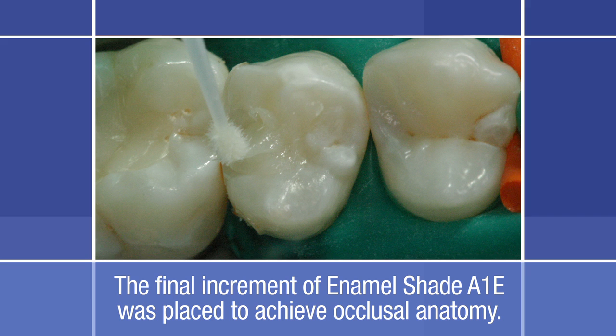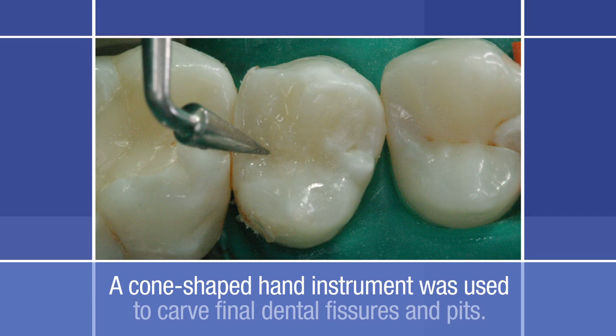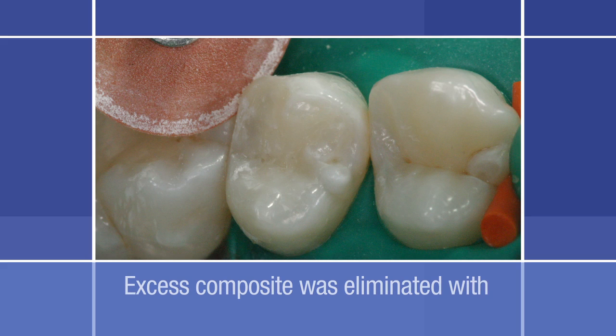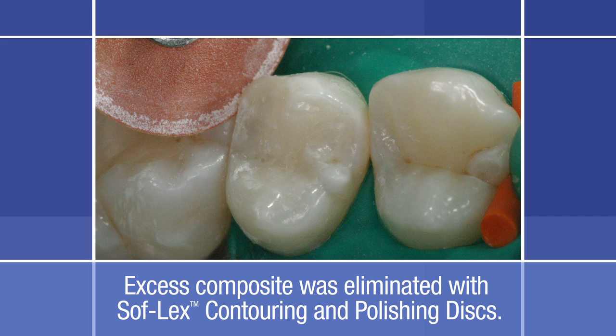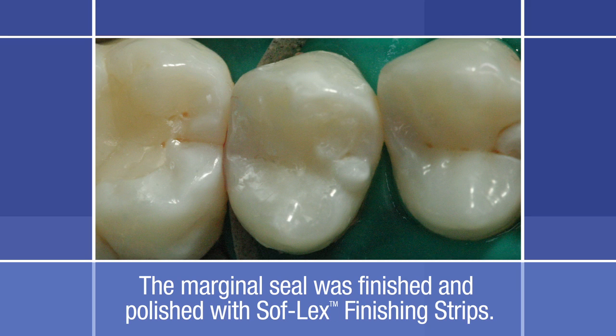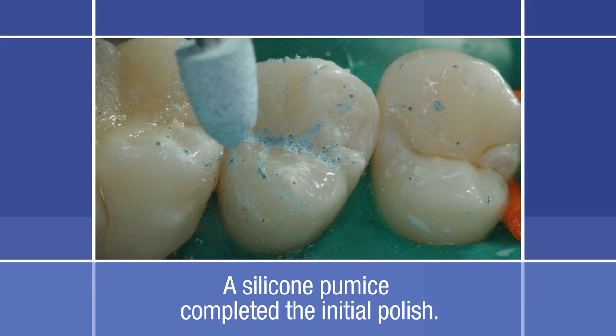This practice minimizes additional finishing with carbide or diamond burrs. A cone-shaped hand instrument was used on the last increment in order to carve the dental fissures and pits. After final curing, composite excess was noted on the buccal and palatal surfaces. This excess was eliminated with medium and fine Sof-Lex contouring and polishing discs. The discs were also used for finishing and polishing the marginal crest. The marginal seal was finished and polished with Sof-Lex finishing strips.